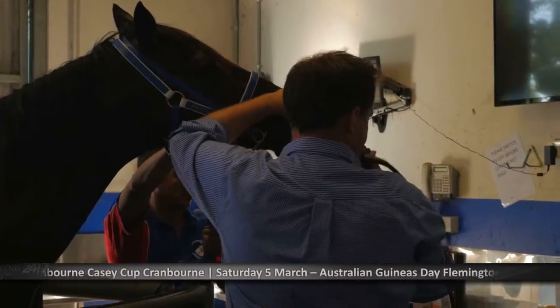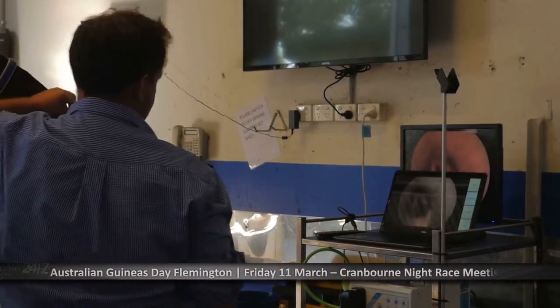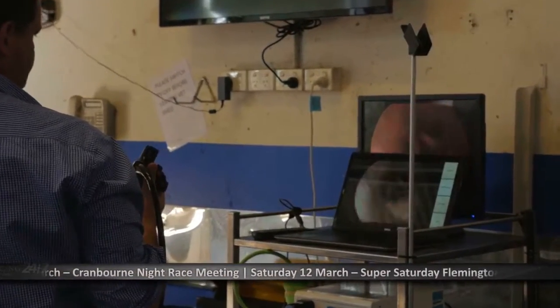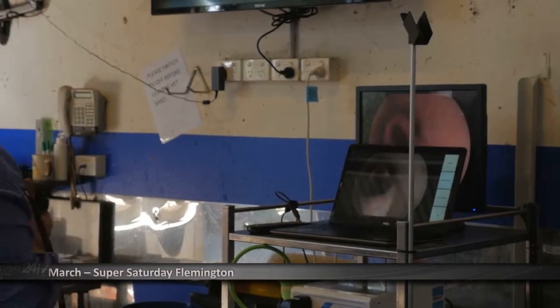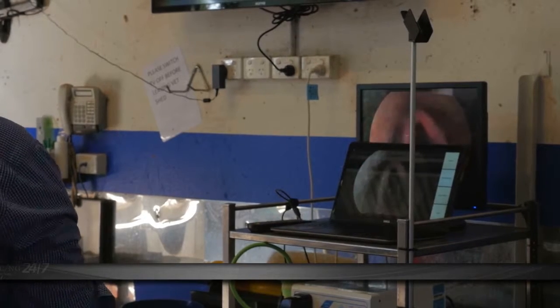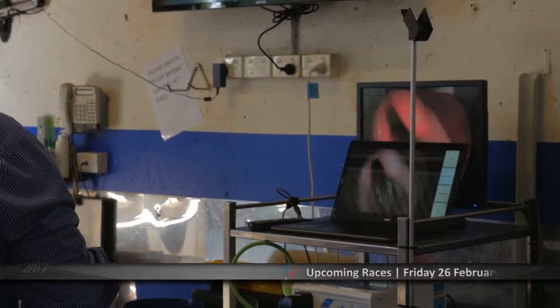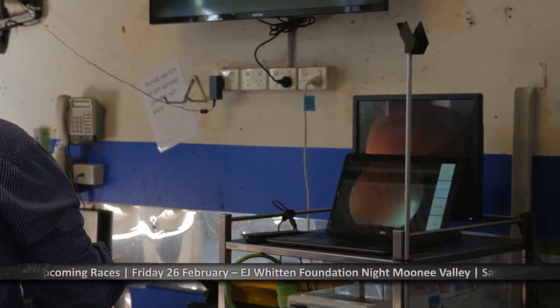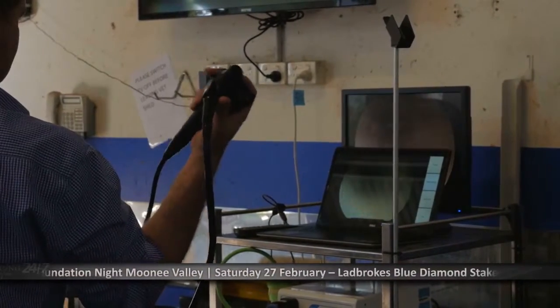Now, if you look on the screen here, we have the throat. We're looking at the throat. The structure at the bottom of the screen that looks like a tongue is actually the epiglottis, and then the tube right in the center of the screen is actually the trachea. So at this stage here, they'll often swallow. It's a natural reflex. And so we pass this scope down into the lungs.